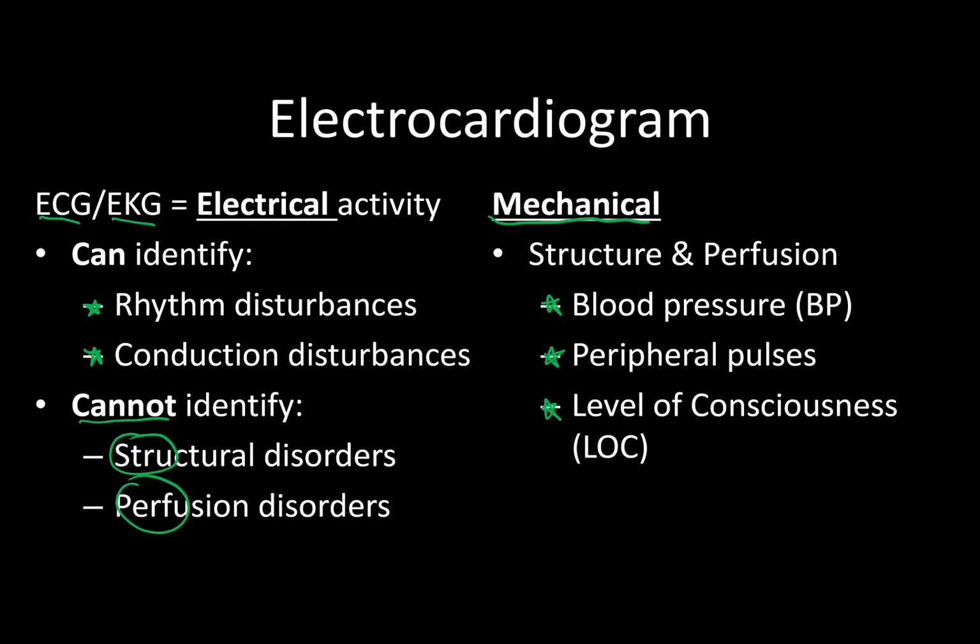The reason I take the time to point this out is because you can't just rely on what you see on the monitor. You have to put eyes on your patient. Look at your patient, get their vital signs, things like that, and see what kind of shape they're in. That's what you have to do beyond just measuring the electrical activity of the heart.